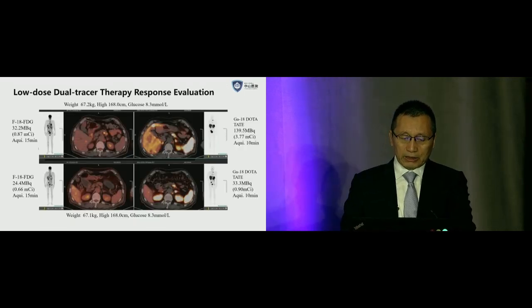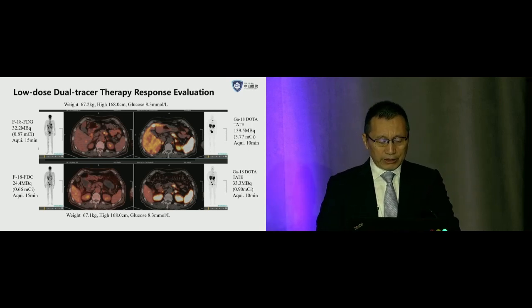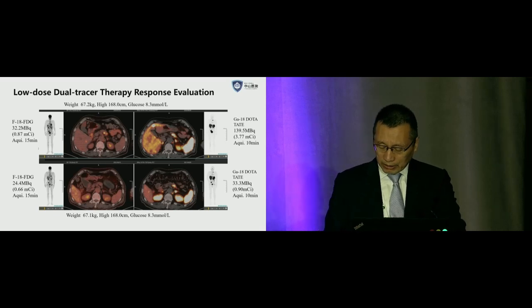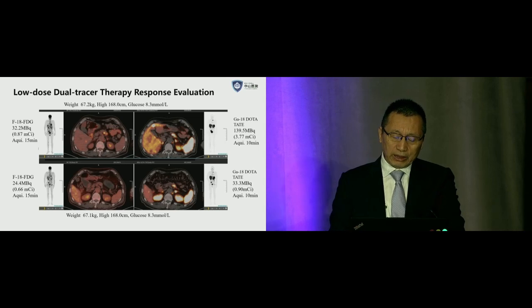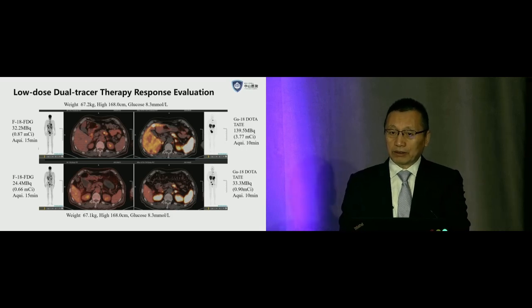And in clinical practice, using multiple tracers together is very popular in clinical work. This is a patient with a neuroendocrine tumor. The first time, we used the 1/10 dose FDG PET. And the second day, we performed the DOTATATE imaging, using 1/3 dose. We can compare them with each other and evaluate the disease. After the therapy, we performed the study again: the 1/10 FDG imaging and the 1/3 DOTATATE imaging. For this kind of imaging, we think it not only reduces the radiation, but also, probably a very important factor, sometimes the generator does not have enough elution. So low dose helps us solve this problem.